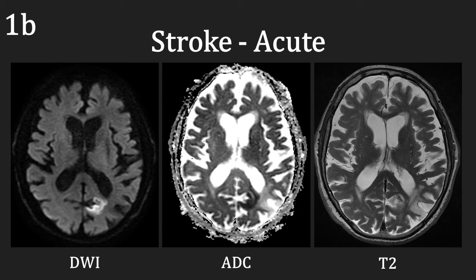Here is another example of an acute infarct or stroke. This is a 92-year-old male patient who presented with sudden onset right-sided blurred vision. We can see in his left occipital lobe that there is an area of high signal on the DWI, low signal on the ADC, and high signal on the T2. This represents an acute infarct.